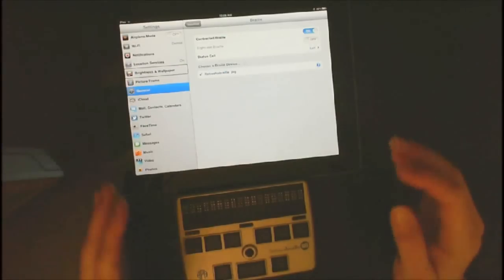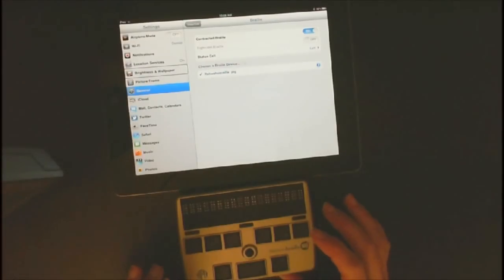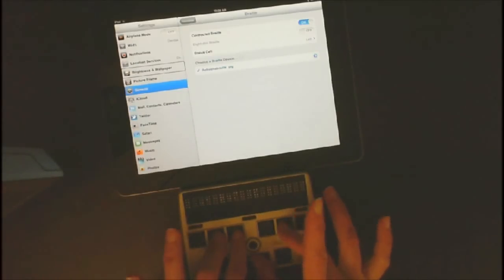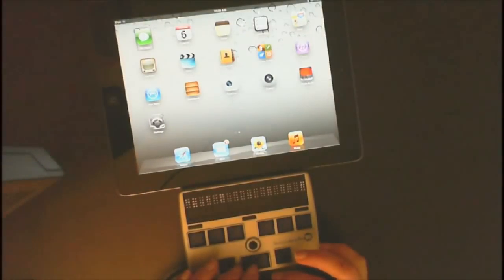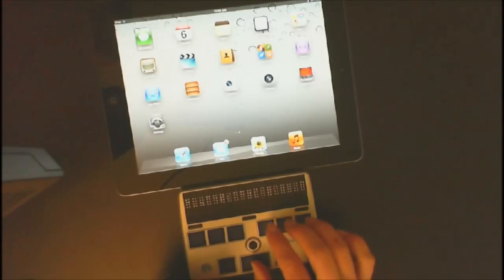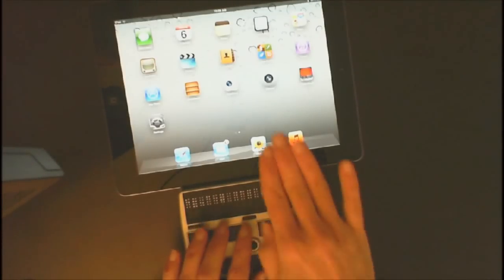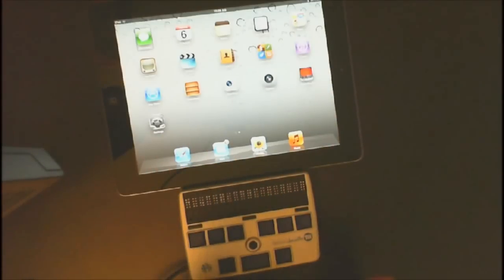From this point on, you can do everything exclusively from the braille display, and that is what we're going to go ahead and do. Now teach your students to use the braille display correctly — dots 1, 2, 3, 4, 5, 6 — and use your thumbs for your space bar and dots 7 and 8. Let's go ahead and go back home by hitting H with space. If you need to pop to the top, it's 1, 2, 3 with space. Pop to the bottom with 4, 5, 6, space — and it moves you to the end. Then 1, 2, 3, space moves you right to the top again. So if your student gets lost within a document, have them go back to home, get to the top, and start over.